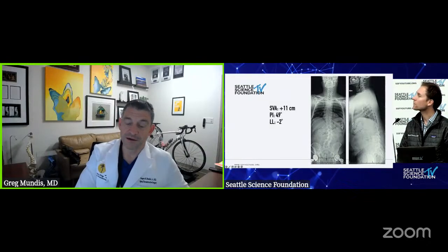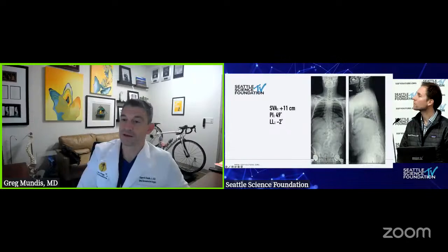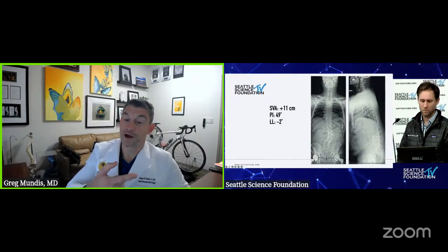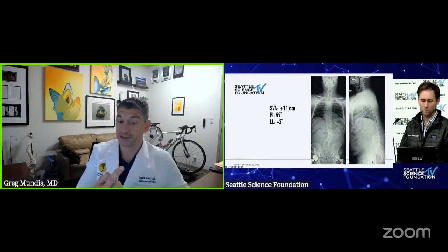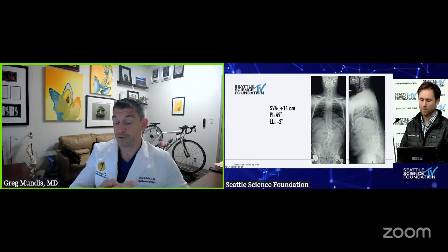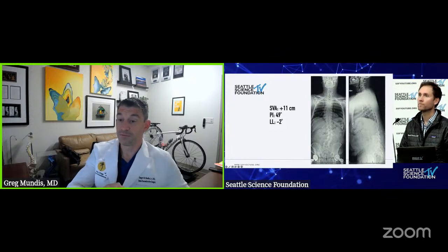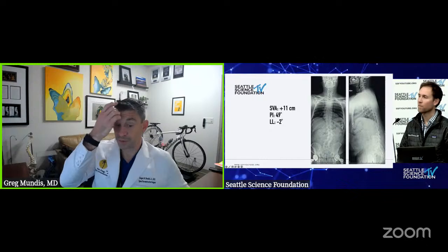I would say he is in danger of malalignment post-operatively because of that. So you have to pick your levels and you have to really, really fix the fractional curve. The L4-5 tilt that you see there, L5 on S1 looks pretty level, but L4 looks really tilted relative to L5. And you've got to get that spot on before you even consider correcting the scoliosis above it. So really critical point on that.